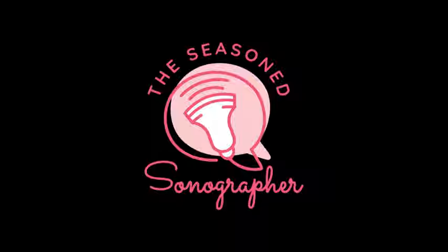The hands are usually clenched in a fist, but you can see if there's any extra digit when you get the cute little footprint for the parents. And also just make sure there's no club foot. So let's talk about fetal biometry.